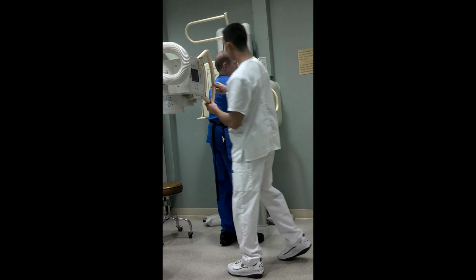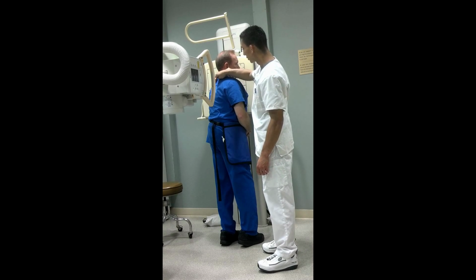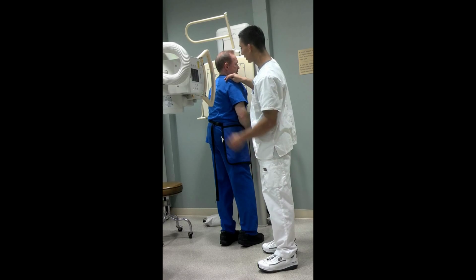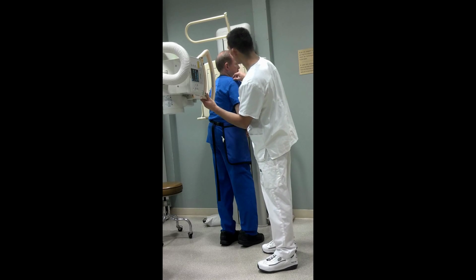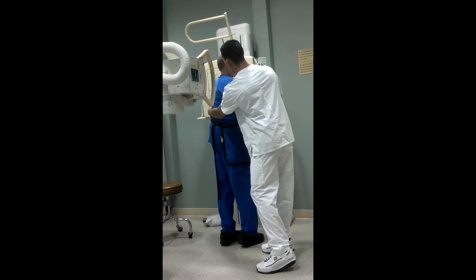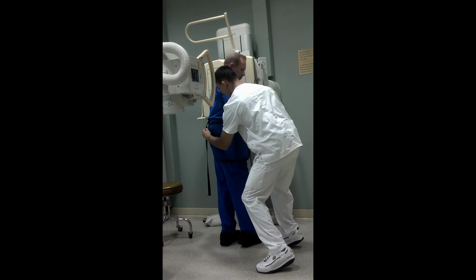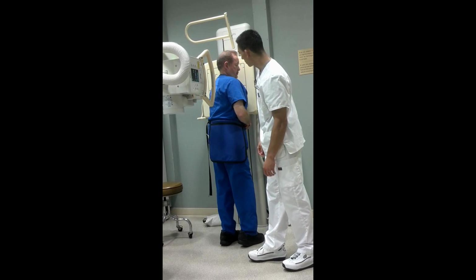And so I'm going to have the central ray here perpendicular to the scapulohumeral joint. Basically, the scapula lined up with the coracoid process to get everything. And looks like we're lined up with everything there. Get a little rotation here, and turn the shield this time on that side where the primary beam is coming from.